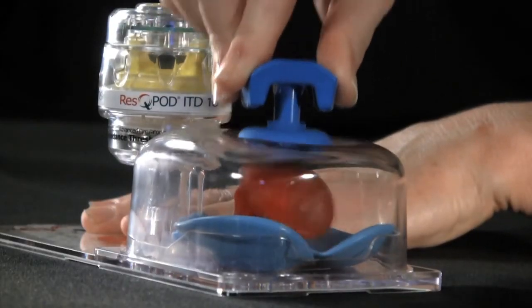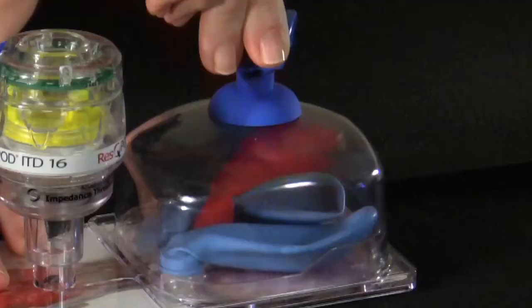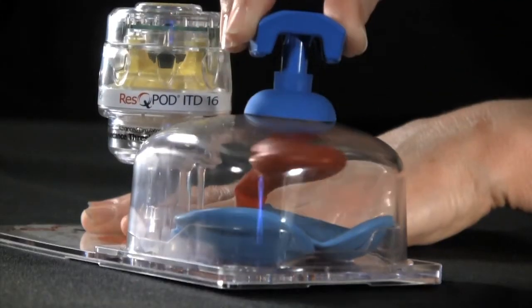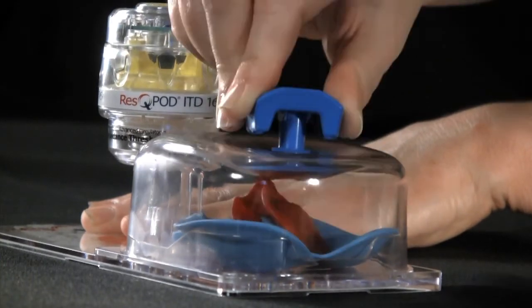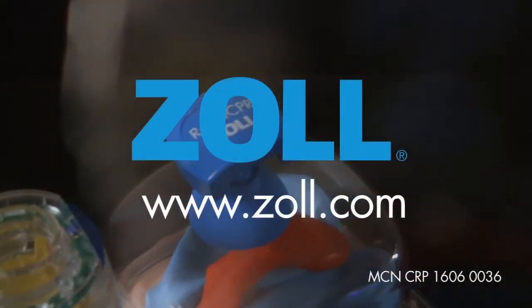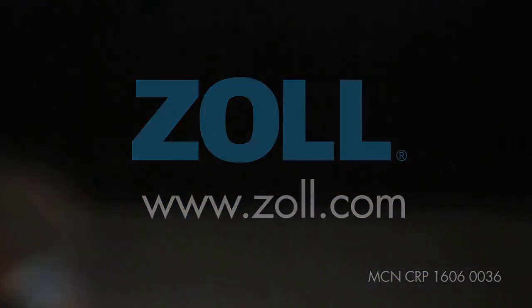By actively re-expanding the chest, it allows the creation of an even greater vacuum. And the rescue pod helps maintain that enhanced vacuum, resulting in near-normal blood flow to the brain and vital organs.